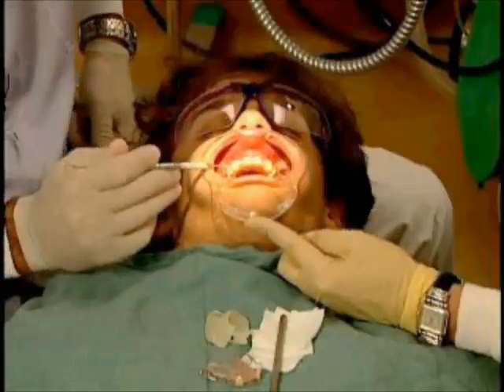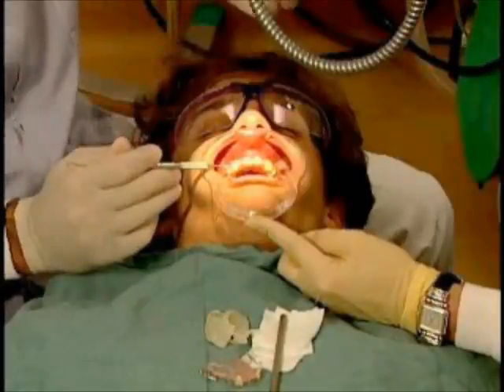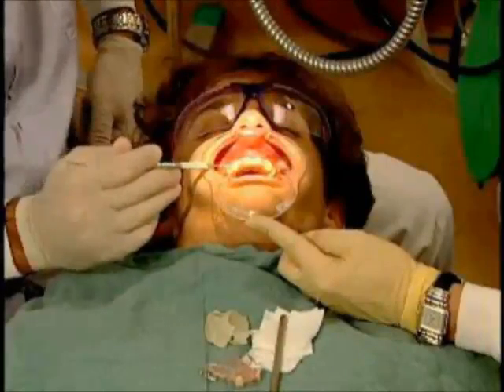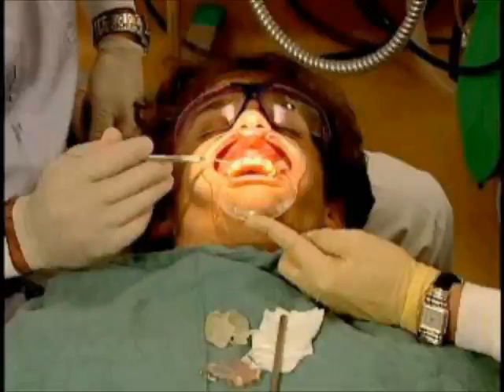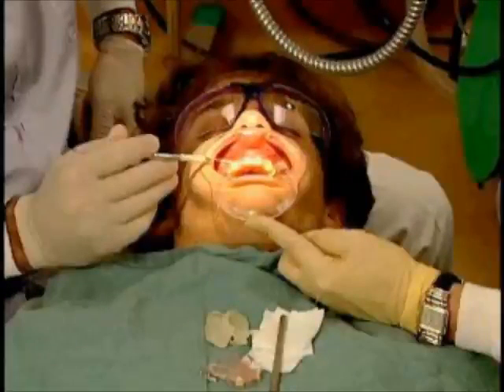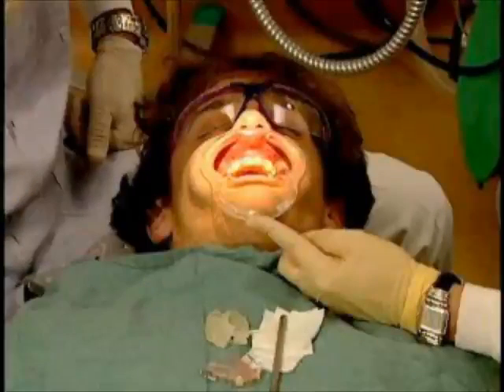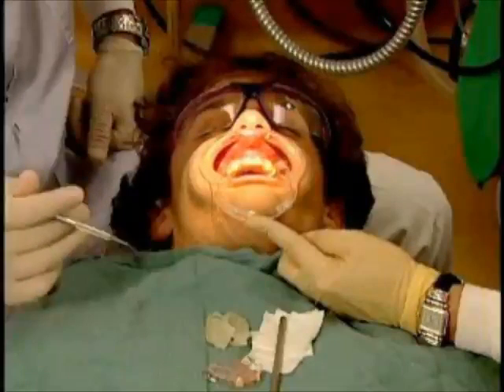We talked about this preoperatively, what kind of abutment Dr. Garber is going to need. We think we can manage with a straight, not angulated abutment, placing the implant towards the palatal wall, and then filling this bony area, the concavity, internally, if we perforate, with bone grafting particles.